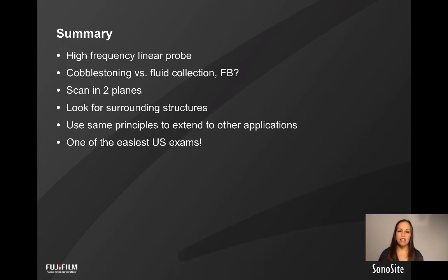As I showed in the example in the neck, you can identify abscesses in the neck and other locations that you may not necessarily be familiar with. And the other example is the cartilage in the pinna, that the same principles of an abscess will extend to those other locations. As you practice these exams, as you look in phantom models, as you practice on patients, you'll find that actually these are amongst the easiest of ultrasound exams. They're also the most helpful in your management of pediatric patients.